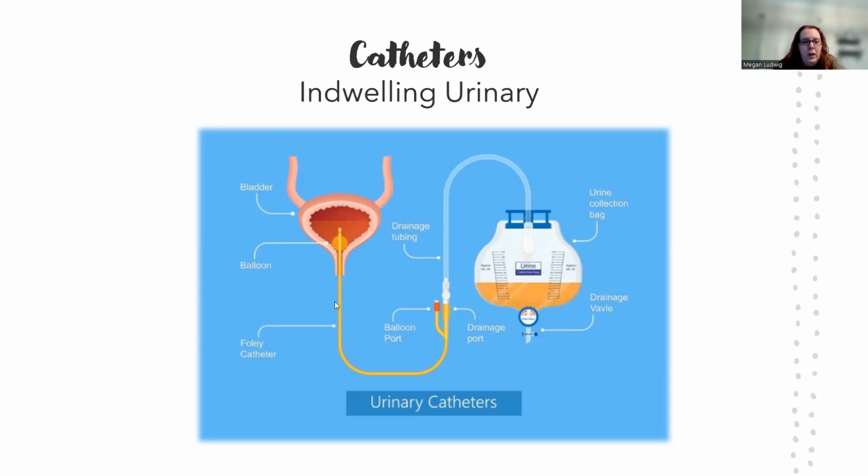Then you've got this whole kit that hooks up to the drainage bag. It could look like this, it could be slightly different, but it's still similar. It has markings to measure how much is there, and you can visualize what the urine looks like, because that could indicate maybe we're working in here, maybe we damaged a ureter and there's going to be blood. You would see blood show up in the urine. So it's a good thing to visualize the urine.